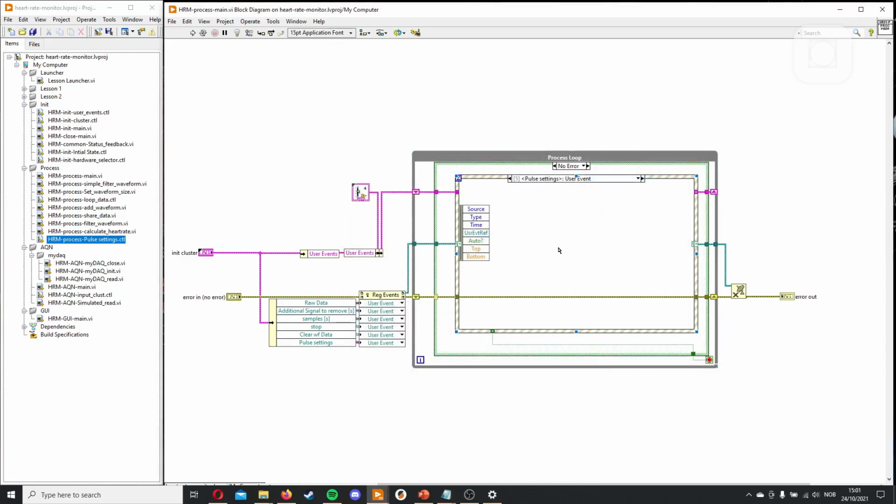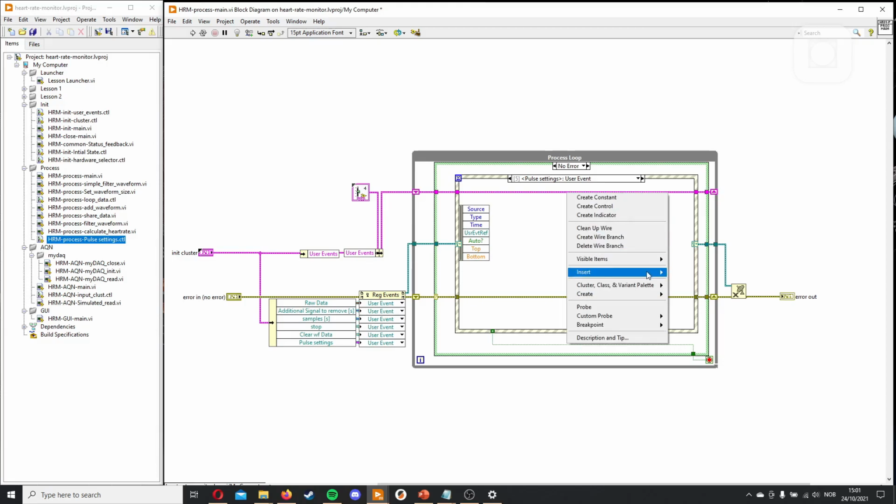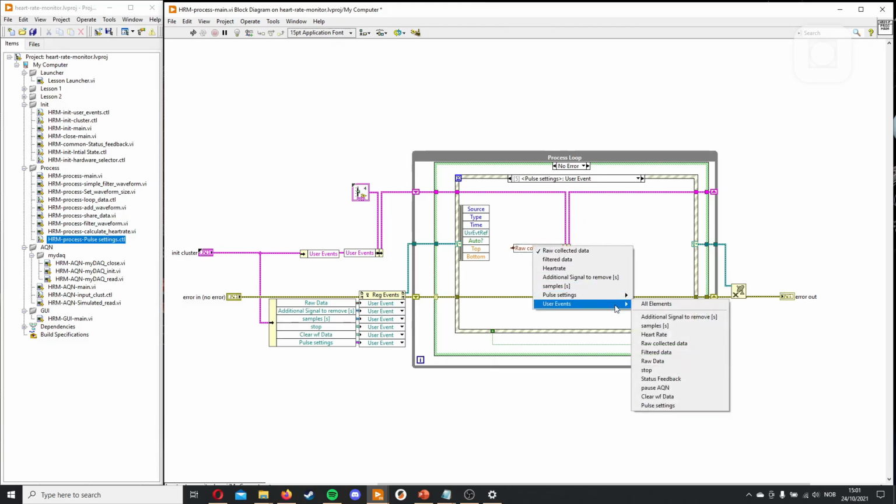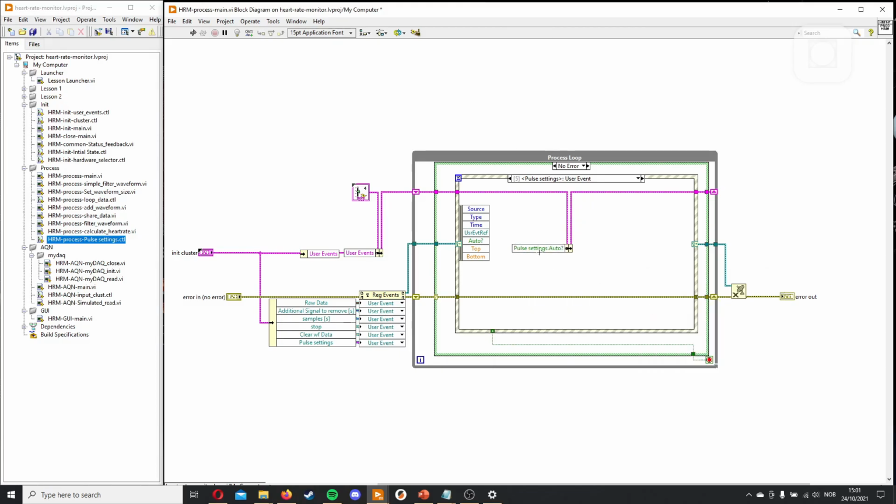And then when you put a cluster into user event, it usually splits them up like this. This can be annoying, and a way around this is to put it into another cluster, then it will come in the same way, because the user event automatically unbundles your cluster. But it's really not a big problem. We'll just manually push them in again. And now when someone sends the data, we'll be saving it in our loop data for later use.